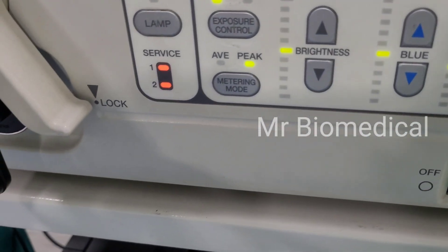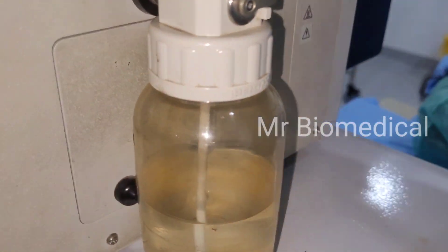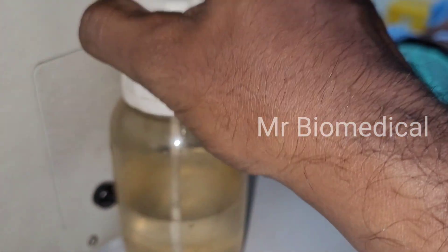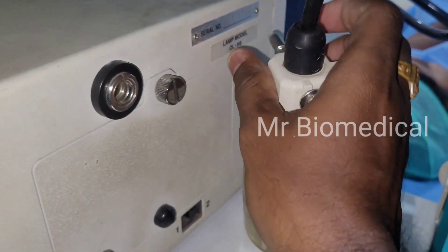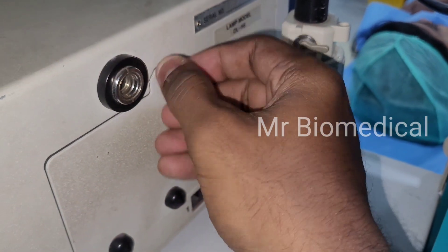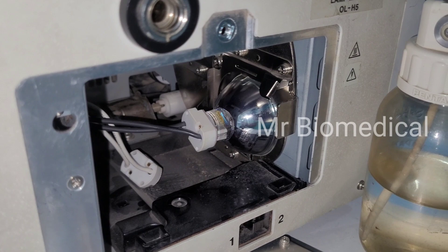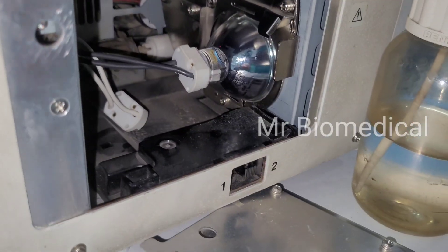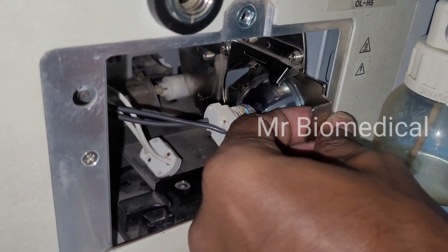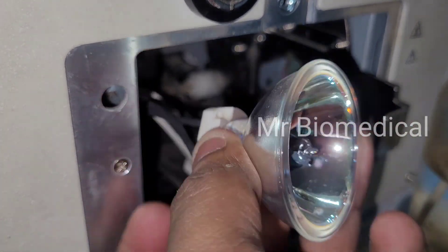There must be a problem with the bulb. I'm removing this ejector bottle and then removing this screw to open the bulb compartment. Inside you can see the bulb — let's remove it.